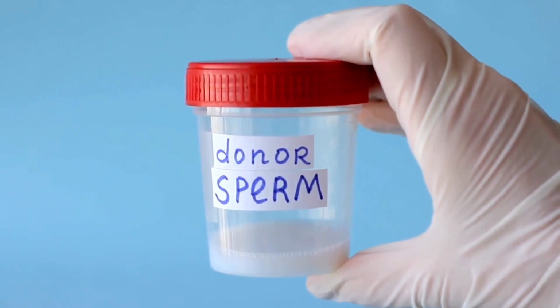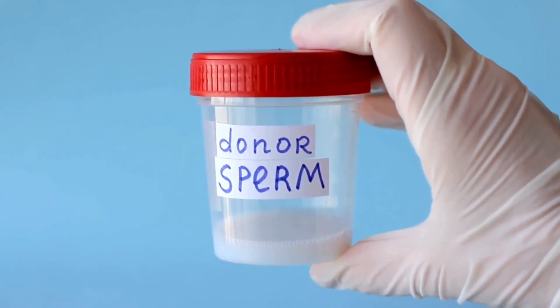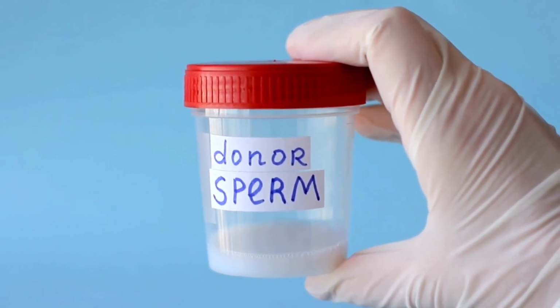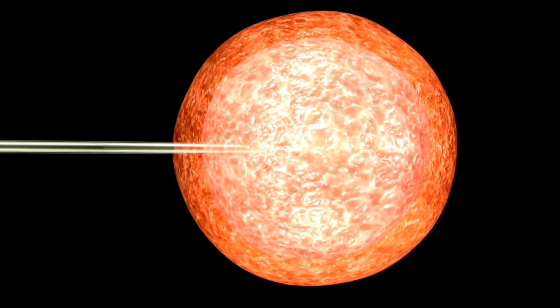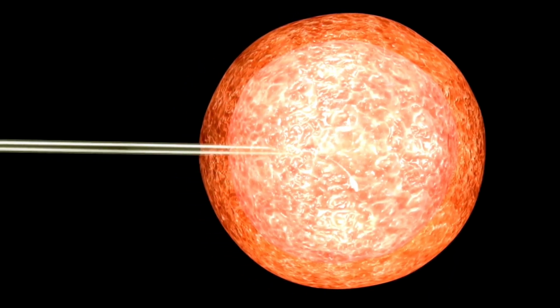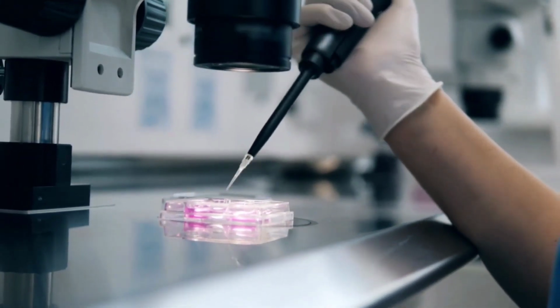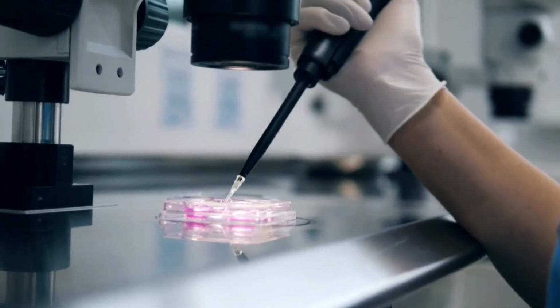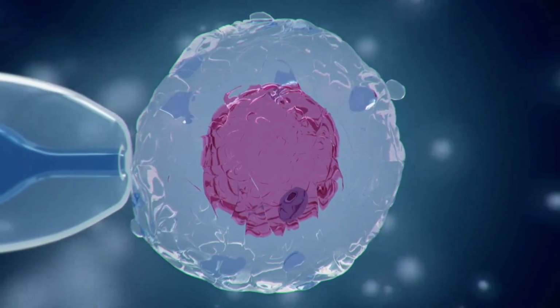Third step: fertilization. Fertilization is the stage of reproduction corresponding to the penetration of a sperm inside an oocyte, which will unite to form an embryo. The prepared spermatozoa are simply placed in contact with the oocytes in a culture dish containing a liquid nutrient medium and placed in an incubator at 37 degrees Celsius. The motile spermatozoa come spontaneously, without external help, into contact with the oocyte. A single spermatozoon will fertilize this one.